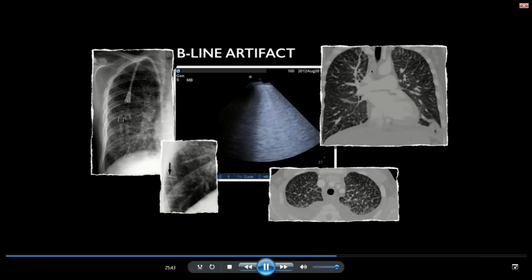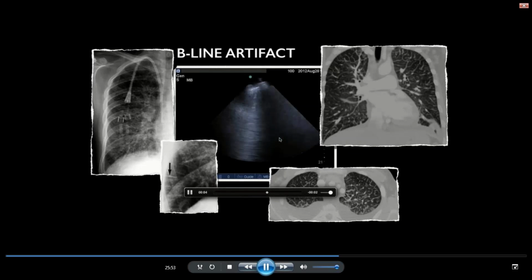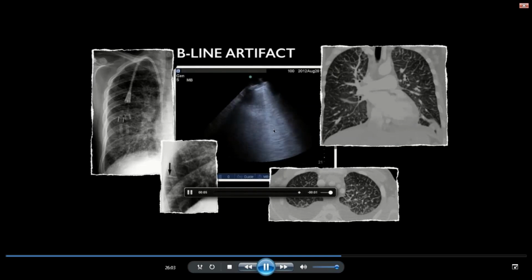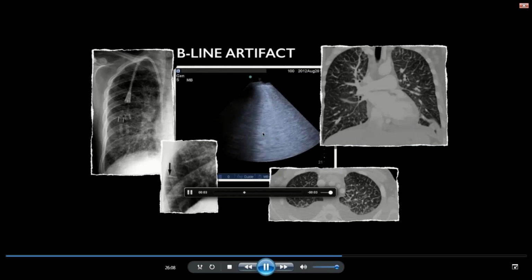As you can see here in the image, one can appreciate several broad B lines in the video. And while B lines form the cornerstone of interstitial syndrome diagnosis, it's really important for us to train our eyes to what they look like. So what we are looking for is these helicopter searchlights in the lung, also known as comet tails, as you've already heard from Dr. Blaivas.